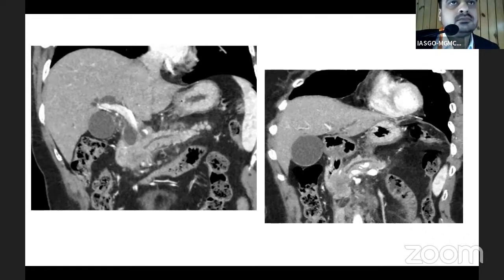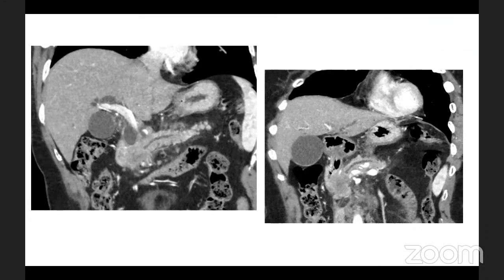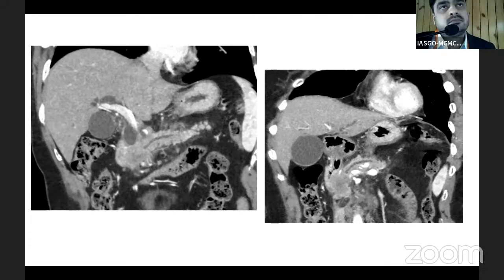But over the years, with the transplant experience, we've seen many donor MRs where the CBDs are dilated. There are no gallstones, obviously, and these are young patients in their early 30s or late 20s. We have followed these up, and the CBDs were mildly dilated, around 11, 12 mm. We just followed them. There's nothing to do. So I don't know, should they really be treated? That was my point. Maybe some of the senior members can answer this.